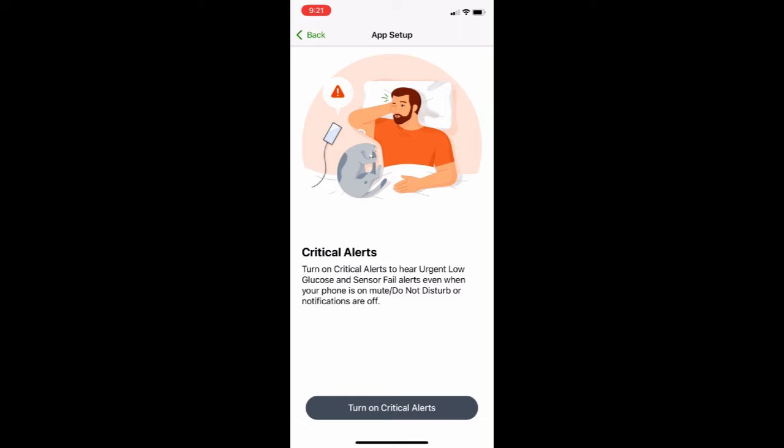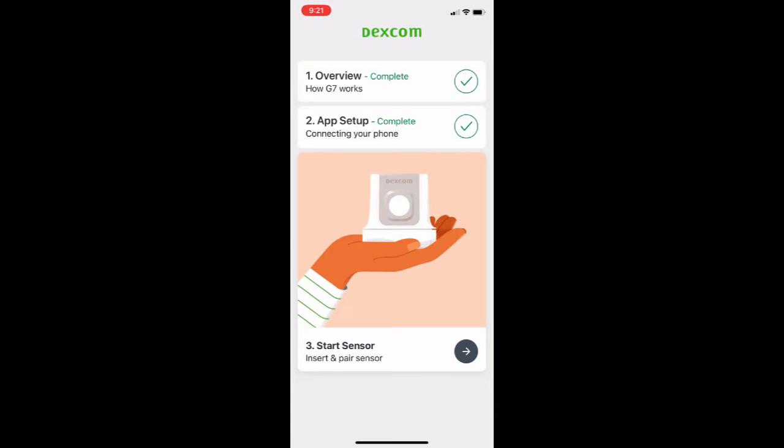Once you've done that, you also have to confirm that you're okay with critical alerts. And then you're ready to start your sensor.